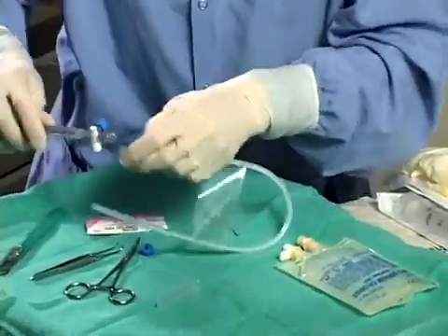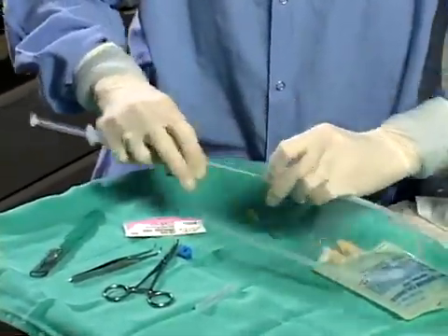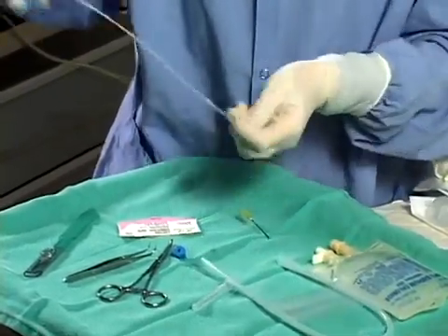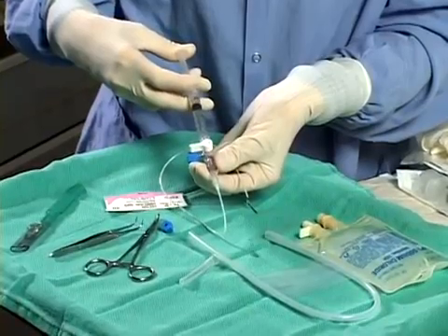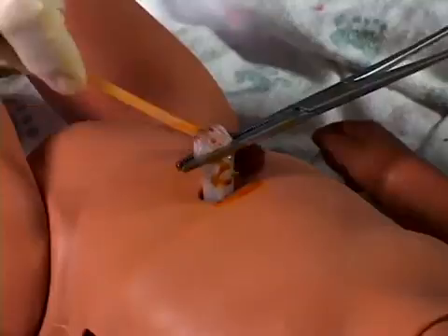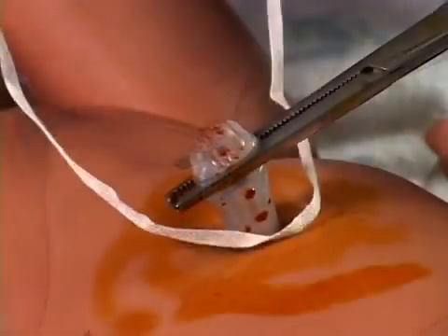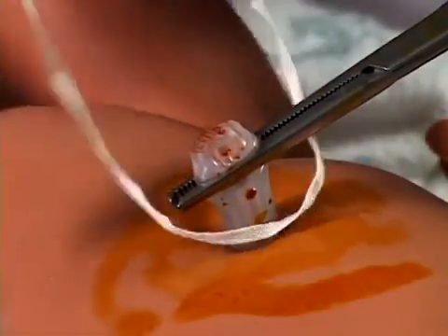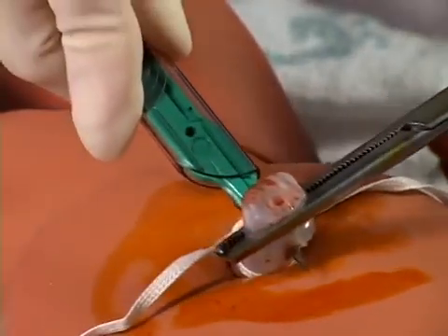To prepare an umbilical venous catheter for emergency medication administration, flush the catheter in three-way stopcock with normal saline. Close the stopcock to the catheter to prevent fluid loss and air entry. Prepare the skin and cord with antiseptic solution. Place an umbilical tie around the base of the cord. Pause compressions and cut the umbilical cord with sterile technique.